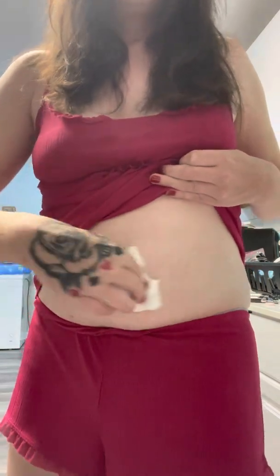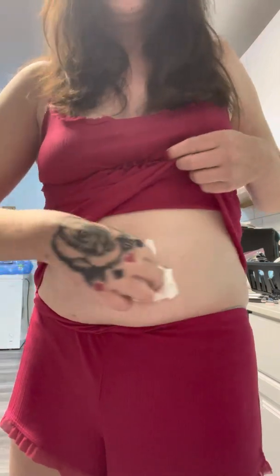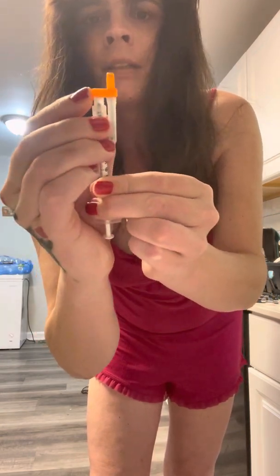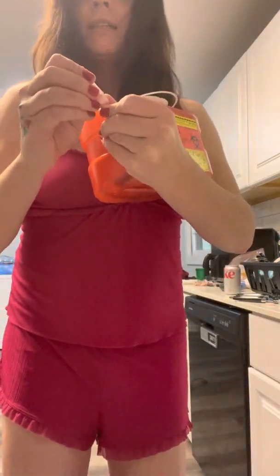Go ahead and pull it out. Now, clean paper towel or napkin — I am just going to put a little bit of alcohol and wipe the area down. I apologize — you only need to poke once; I did not inject the first poke. I saw a bubble in the syringe and you do not want to get a bubble in your syringe. These needles, when you are done with them, you just press this and the needle is gone so it is no longer dangerous. And I have my sharps container — I'm going to go ahead and place that, and this is the drawing needle, I'm going to go ahead and place it in its safety so that it is in a nice safe place.